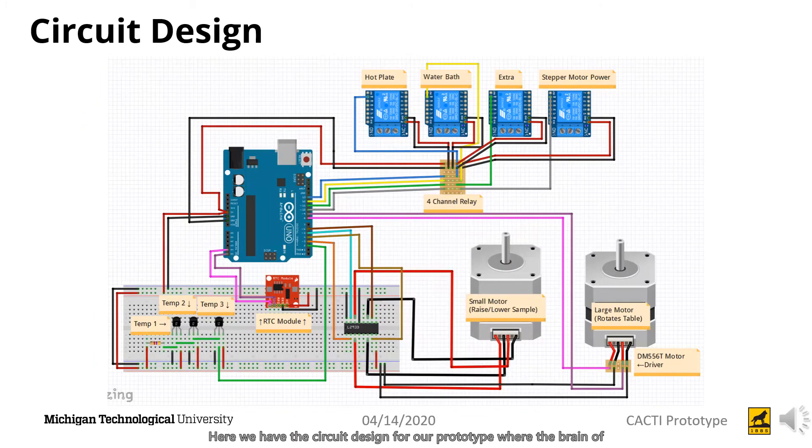Here we have the circuit design for our prototype, where the brain of the design is an Arduino Uno, using relays, temperature sensors, a real-time clock module, and stepper motors as well as their drivers to sense and control the machine. The relays control the power to the hot plate, water bath, and stepper motor to conserve energy when they are not needed. The temperature sensor and RTC module sense and detect when each step starts and is completed, sending their information to the GUI where it can be read in real time. The stepper motors move the sample between stations, where the small motor raises and lowers it while the larger motor turns the table to each step.